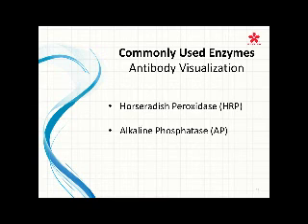And the HRP in the presence of hydrogen peroxide, which is the substrate. So with the horseradish peroxidase, your hydrogen peroxide acts as the substrate. The enzyme is fused with the secondary antibody, and the substrate of the hydrogen peroxide and the chromogen react to create the color that you actually see whenever you perform your stain. And this will identify the site of the antibody binding by forming a colored compound such as DAB and AEC, DAB being the brown color that you see, AEC being the red color that some of us use in our laboratories. Again, I'll go over that in the next slide.